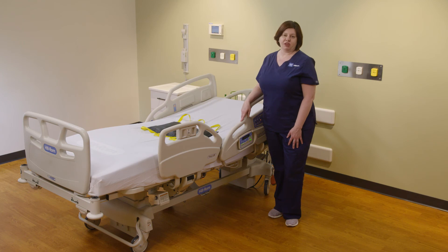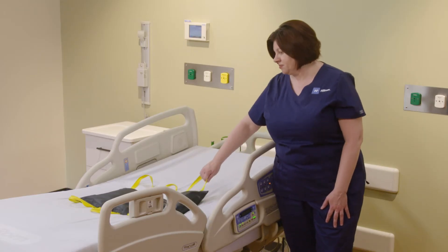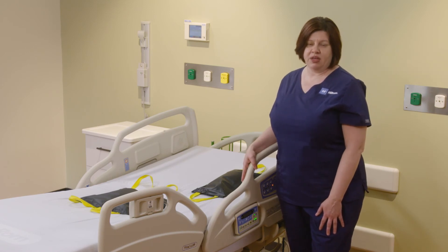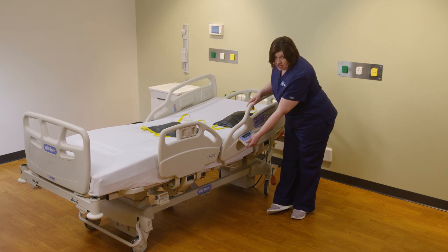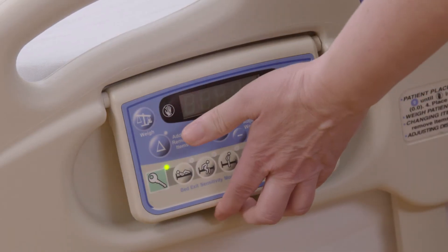In the event your patient attempts to get out of bed without assistance and triggers a bed exit alarm, you will hear the alarm sound. The caregiver enters the room and attends to the patient. You may then disengage the alarm by activating the green key and pushing the deactivate button.